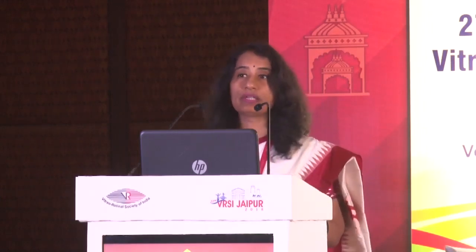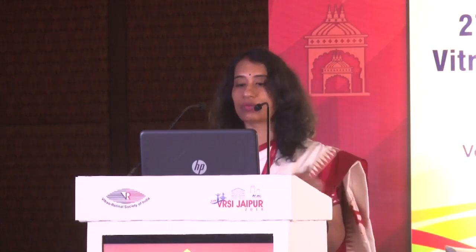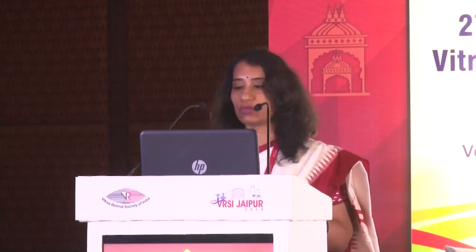So again, ERG can also help us to talk about the diseases of the inner retina in acquired retinopathies like central retinal vein occlusion, for example. The 30 hertz flicker time is said to be the most predictive ERG parameter for NVI, with a cutoff value of 40 milliseconds. This actually looks like ischemic CRVO, but based on ERG, we can tell that it's actually non-ischemic CRVO. This is a normal ERG for comparison.